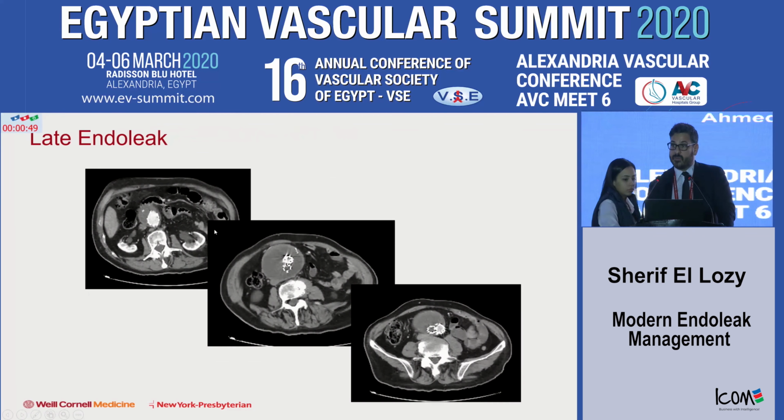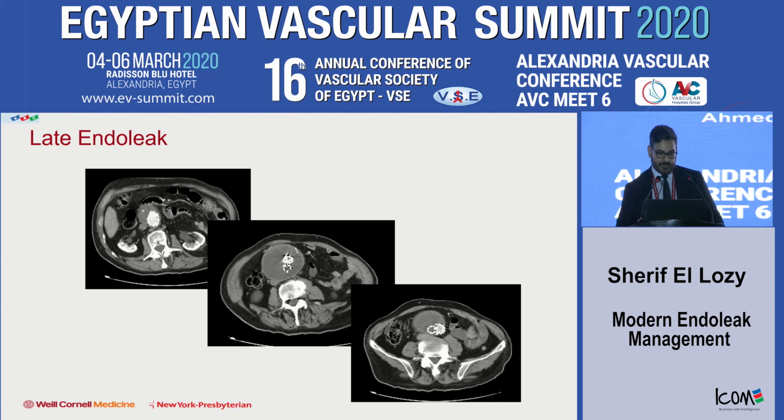Appropriate preoperative imaging with dynamic imaging allows you to determine where the endoleak is coming from, and then you have a number of access options to allow for effective treatment. And I guess I'll end it there.